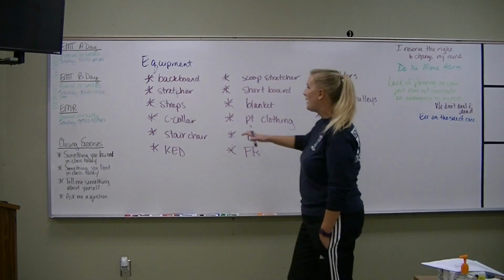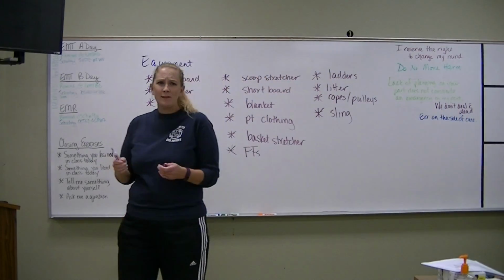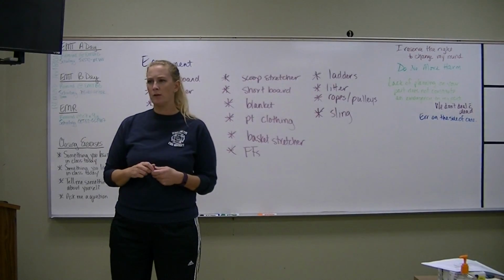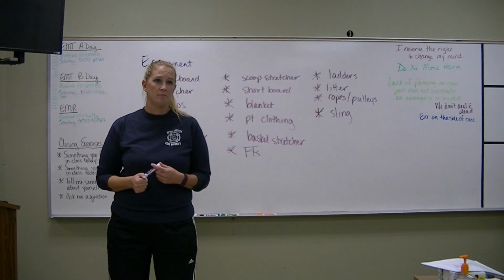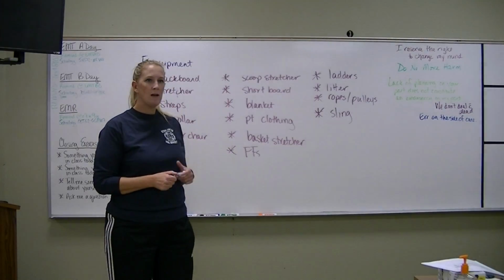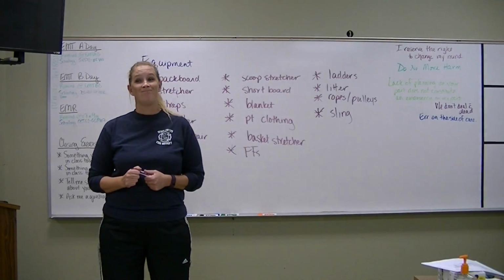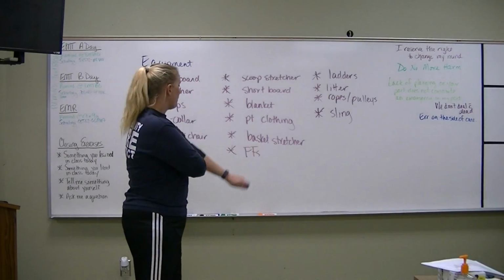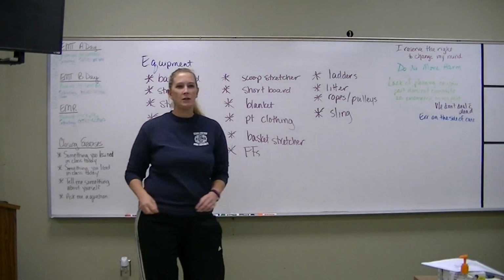We talked about straps. In this classroom, we have 3 different types of straps, right? We've got spider straps, we've got buckle clips, and we have tape. Does tape work for straps? Yeah. So all of these are pieces of equipment that we might use when we need to move our patient.